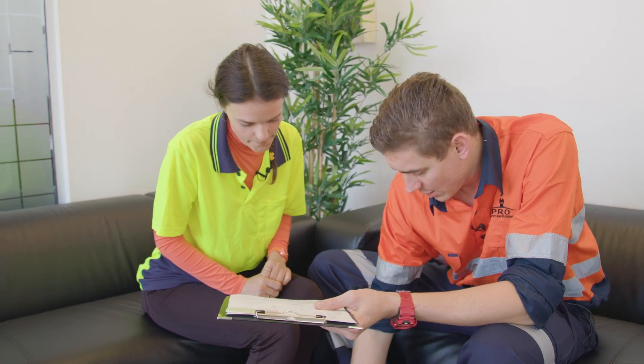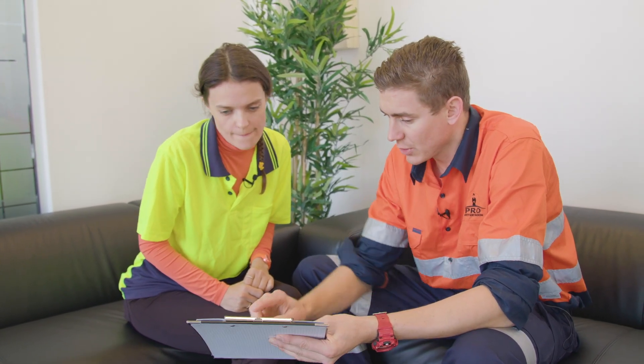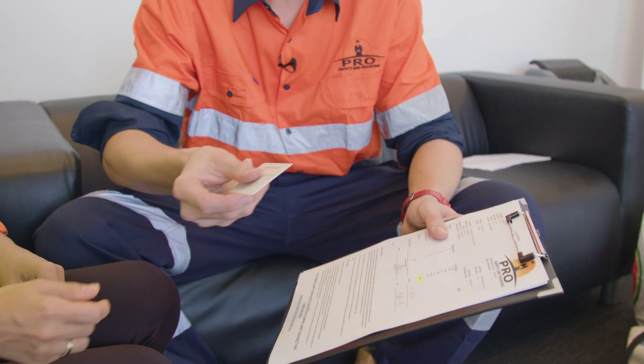So Yulia, we've basically done all the testing now. With a small medium respirator you passed with an overall fit factor of 8835 — that's well and truly a pass. I'm going to give you this card here to prove you've been fit tested.